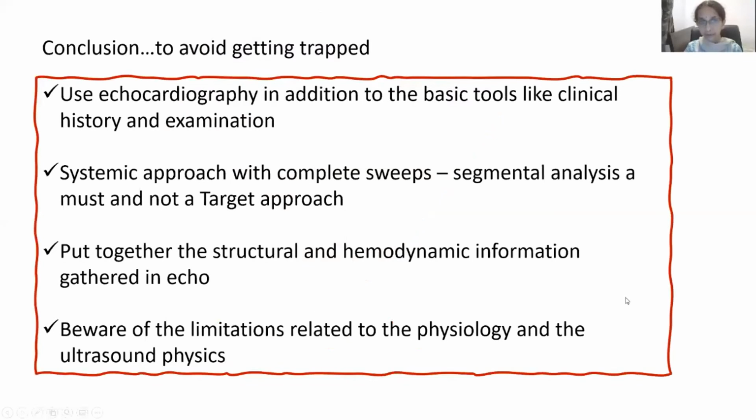So it's important that we put the whole picture together, and do echo only after a basic clinical history and examination. Complete sweep is a must, and do not just have a target approach. It's important to put the hemodynamics together with the structural information, and we need to understand that there are limitations related to physiology and the physics of ultrasound.